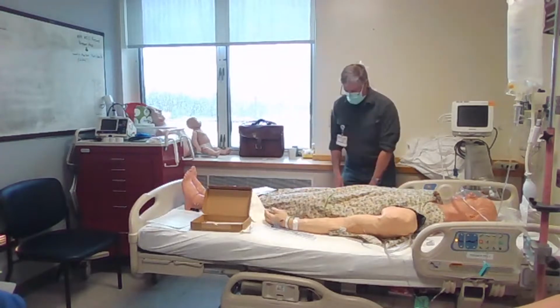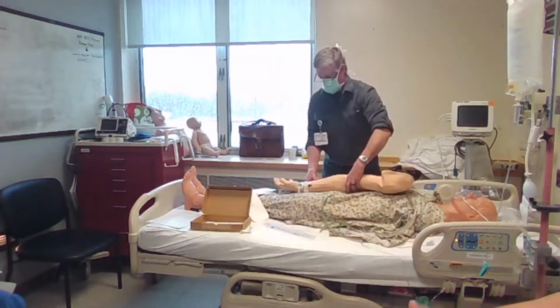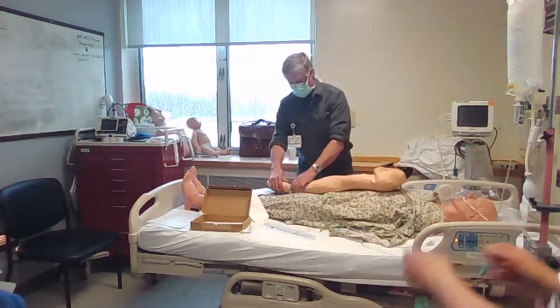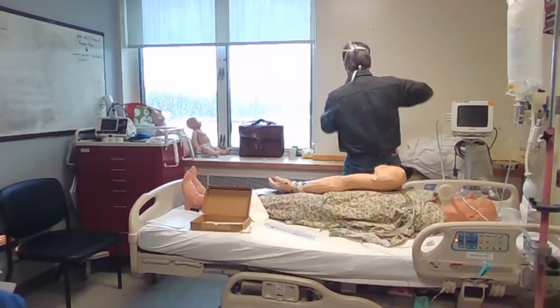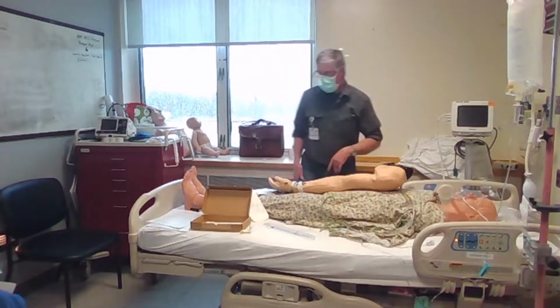Okay, so I'd come over here. And it's just like an IV too, you want to make sure that you're inserting towards the heart, right? Yeah, always think about going towards the heart. So you want to position yourself that way too, so you're going the right direction. Otherwise you'd be sitting right like this, but you're trying to get it to go with your other hand, left and right. You want the flow.